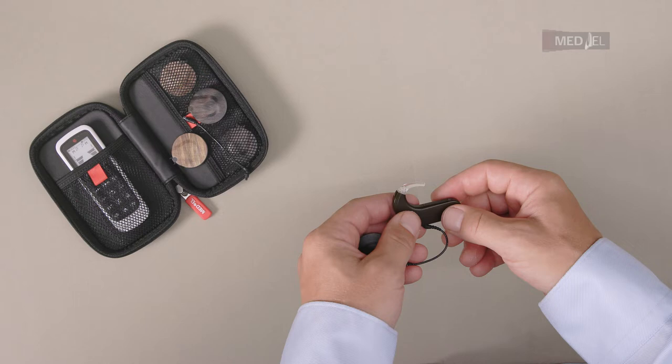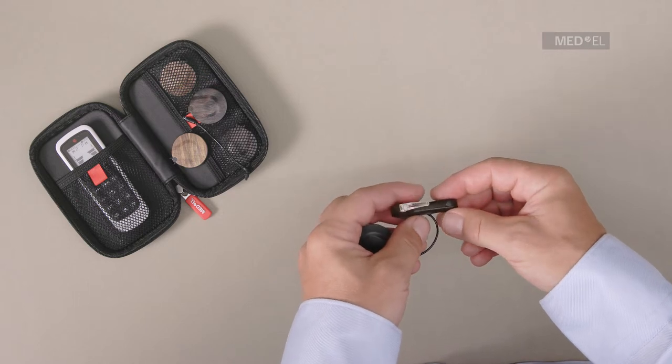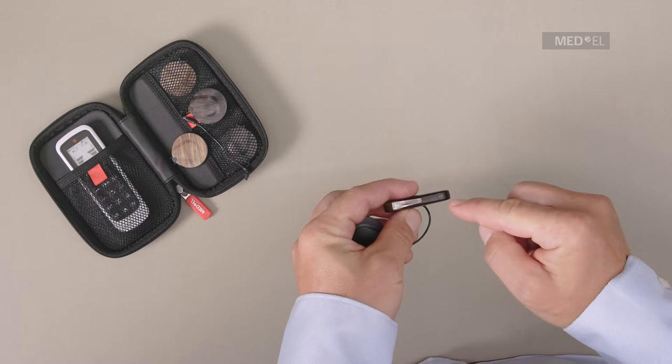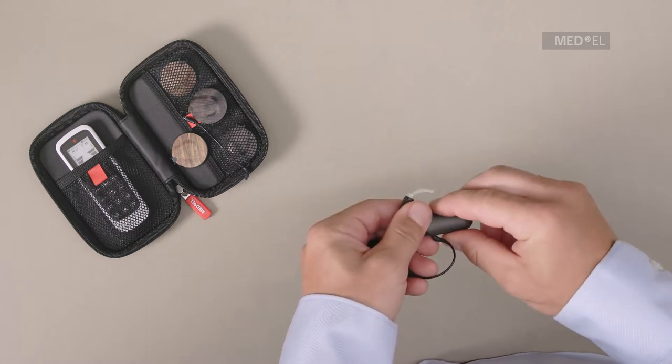To detach the coil cable from the audio processor, first remove the battery pack cover. Make sure that the battery pack cover lock is in the vertical unlocked position.